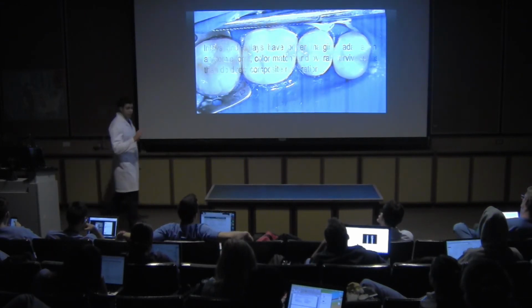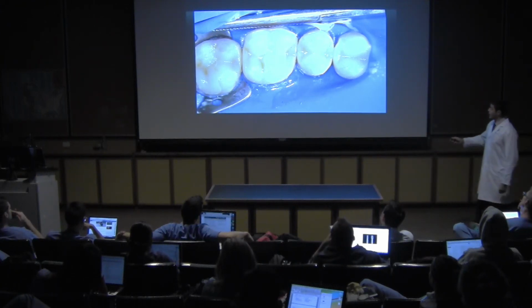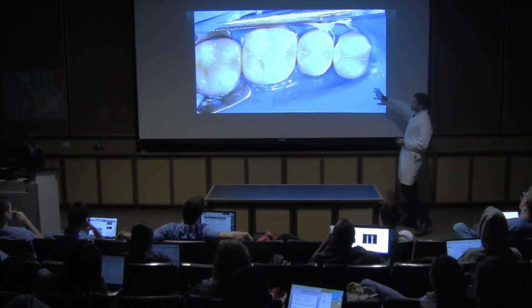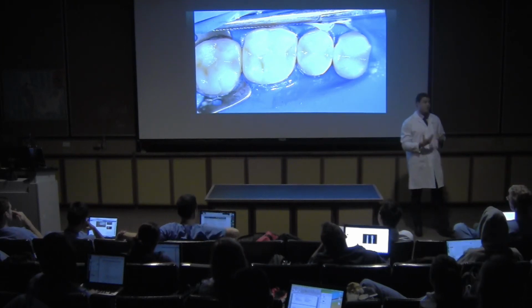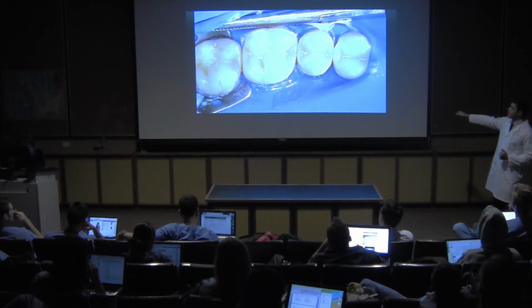Here we have four indirect restorations on these four teeth, and we cannot see the margin. We can see that we have very good aesthetics here. It's completely different, and after some time, like 3, 4, 6, 7 years, we still have aesthetics pretty similar to that on indirect procedures.